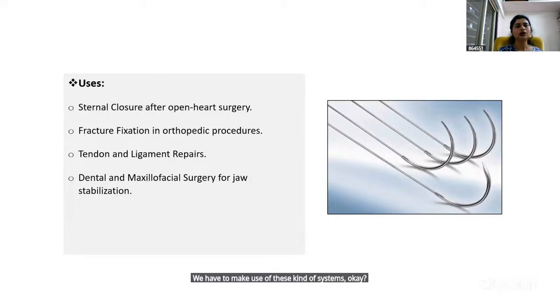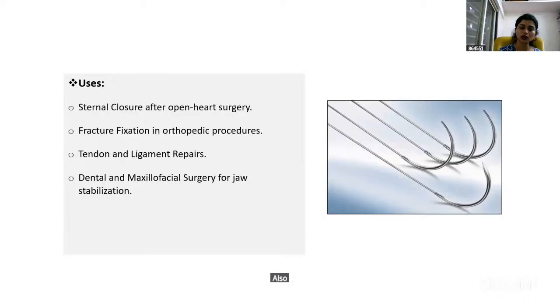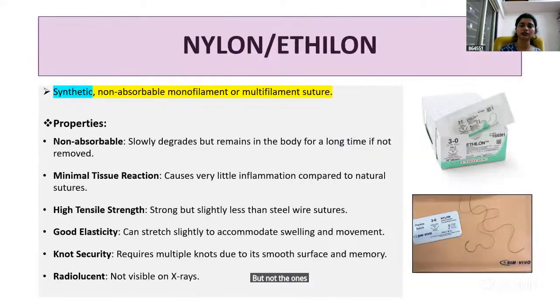For fracture fixation and orthopedic procedures, they are used very commonly, also for tendon repair and ligament repair. But they are not very commonly used in oral and maxillofacial surgery. We make use of wires, but not the ones with incorporated needles.